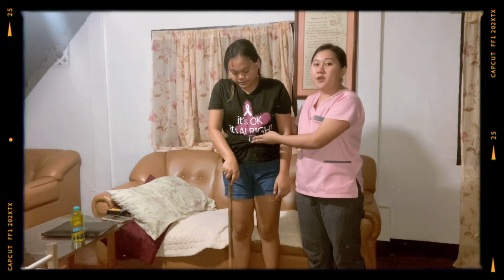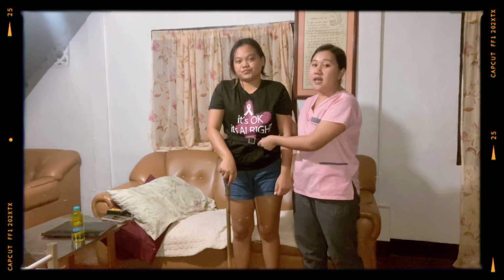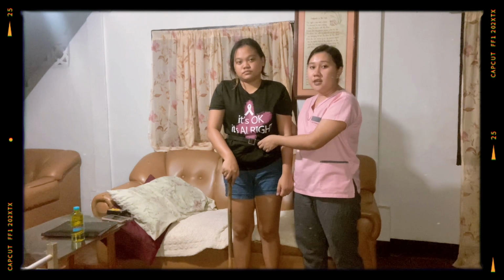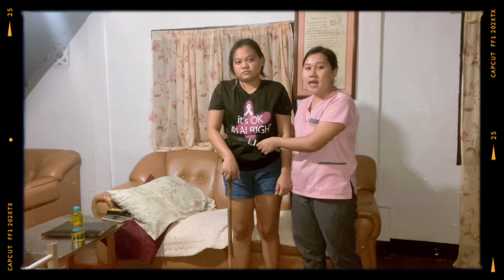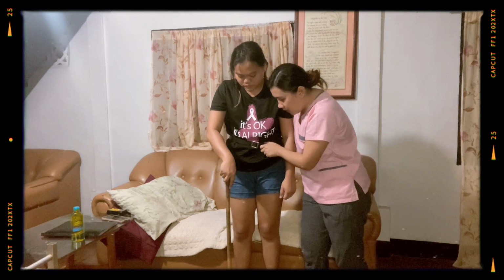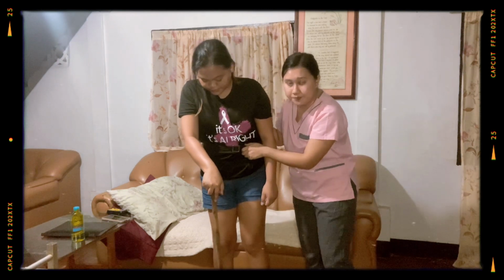So for procedure number 8, tell the patient to advance the cane 4 to 12 inches, so 10 to 30 centimeters, while supporting his or her weight on the stronger leg and the cane. Then advance the weaker foot forward parallel with the cane. This is to maintain the maximum support that is required for the patient's balance and safety. So, ma'am, I will move the cane first, okay? So next. Okay, good.